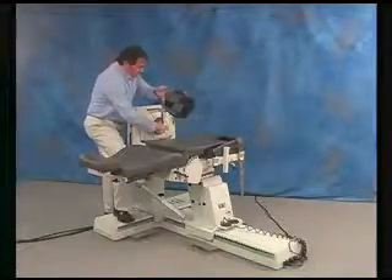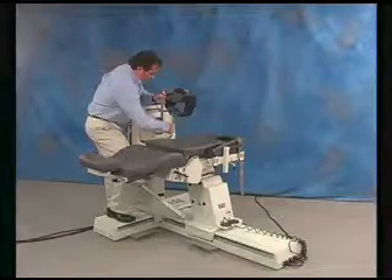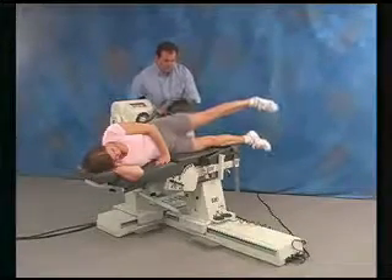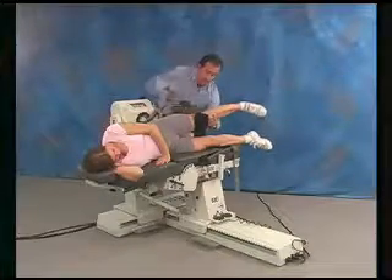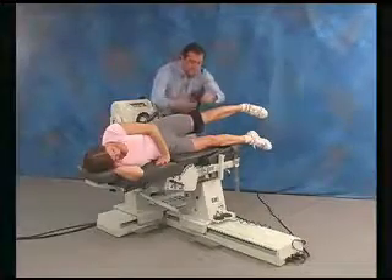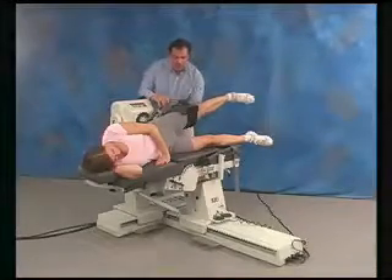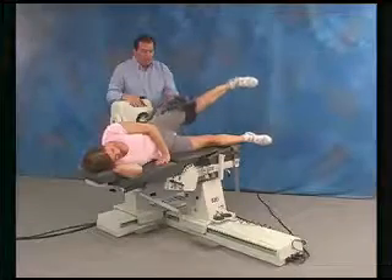Attach appropriate side hip attachment. Fix the patient to the attachment. Align axis of rotation and set range of motion limits.